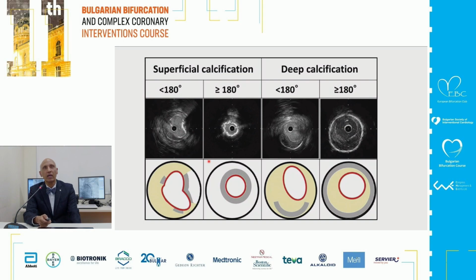Now the calcification can be either superficial or deep, and deep calcification is very hard to treat because of the fact that you don't have devices that extend all that way. So for example, rotational atherectomy or laser angioplasty or other debulking devices will not really work, but maybe lithotripsy in this situation may work. Whereas these lesions can be cracked with plaque modifiers, in these lesions the vessel does not dilate, and though you may get rid of some of this plaque, the calcific segment will not really expand unless you use something that extends into the deeper layers of the vessel, so you can actually crack that part of the vessel and expand your stent appropriately.